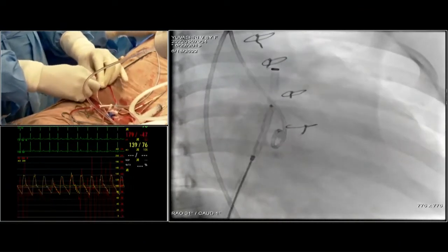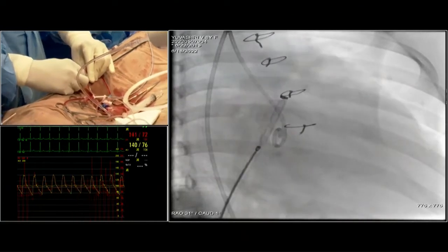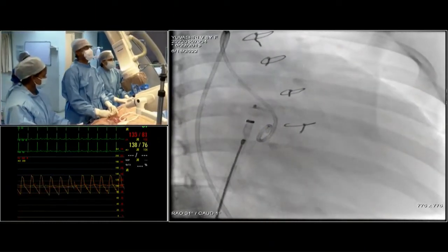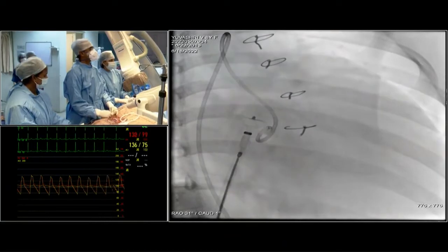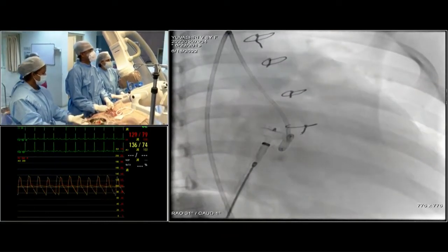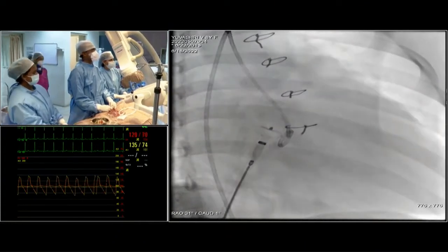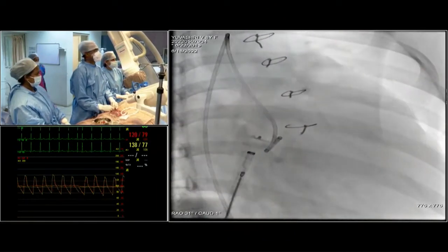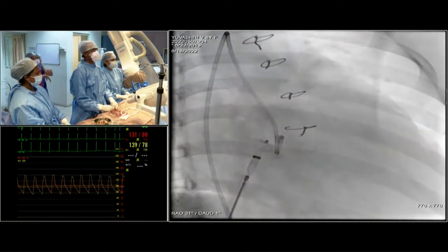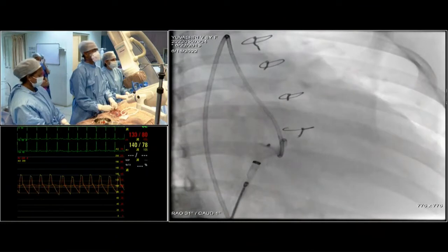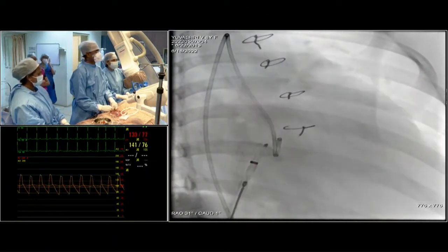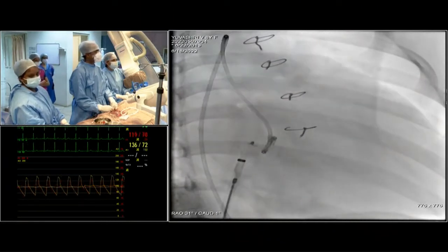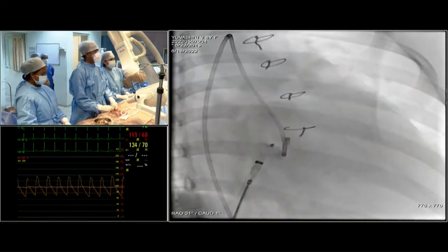It's a pleasure doing this procedure in front of you — you are a master of this field, and RSOV textbooks bear your name. Now I am slowly withdrawing, keeping the non-coronary cusp as a landmark. We can use a small amount of contrast alongside pressure monitoring — I am continuously showing the pressure trace. The catheter is hemodynamically damped, confirming position.